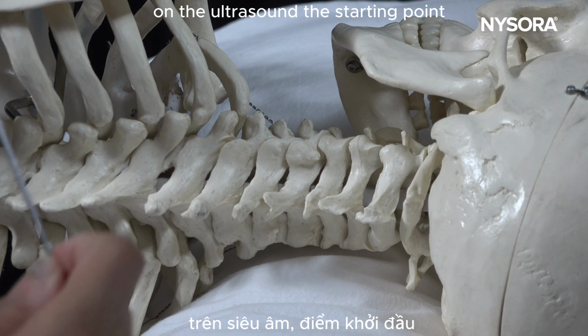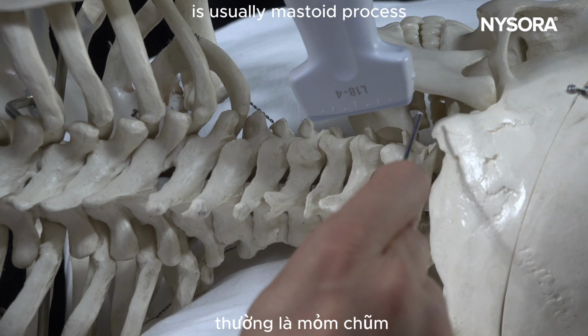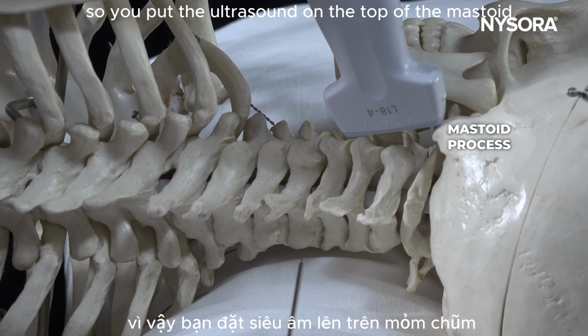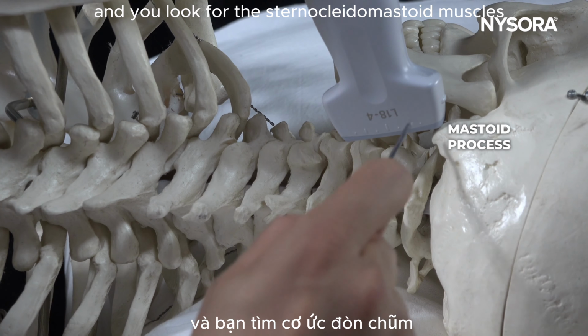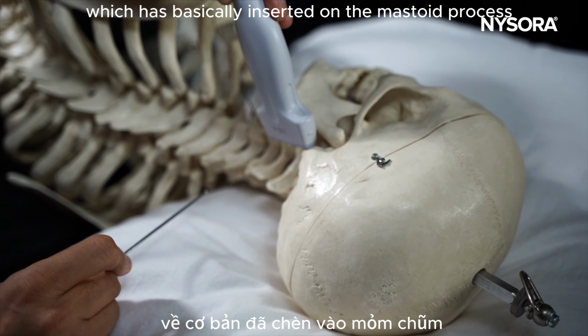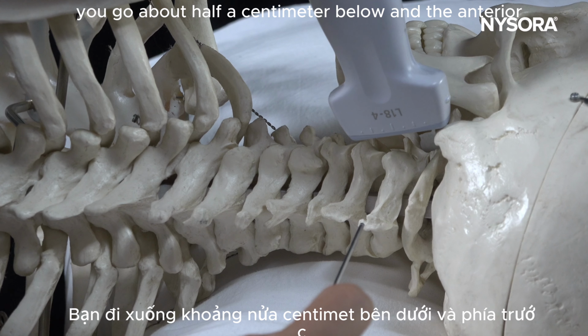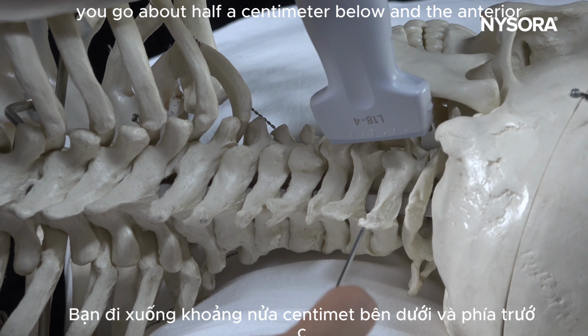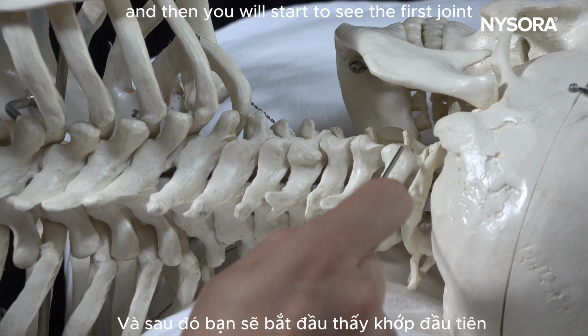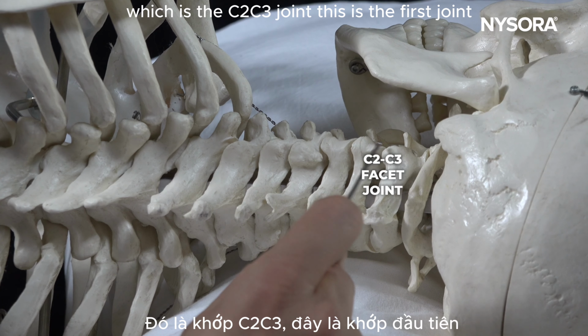The starting point when you use ultrasound guidance for the cervical medial branches is usually the mastoid process. So you put the ultrasound on the top of the mastoid process and you look for the sternocleidomastoid muscle, which basically inserts on the mastoid process. Once you have done that, you go about half a centimeter below and anterior, and then you will start to see the first joint, which is the C2-C3 joint.